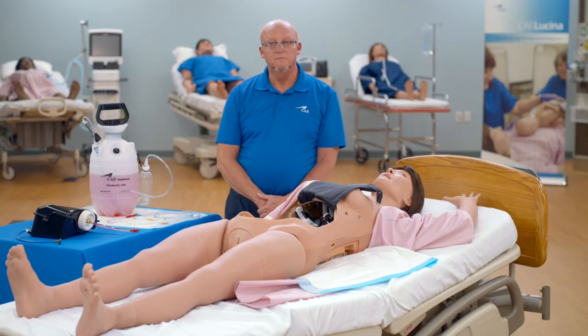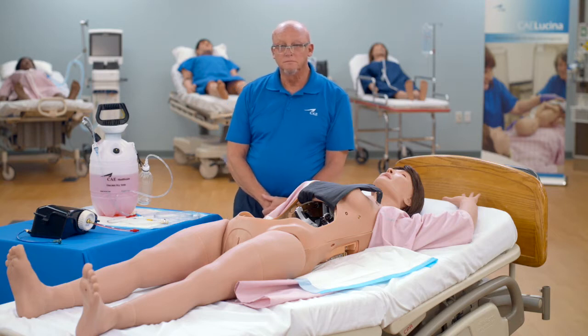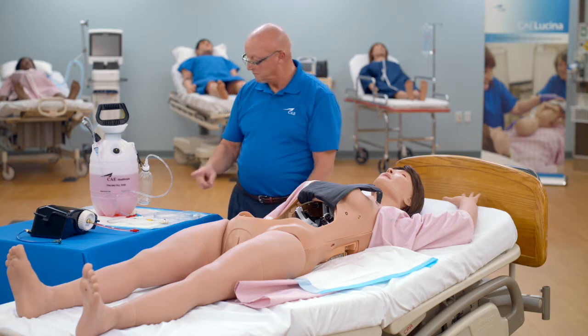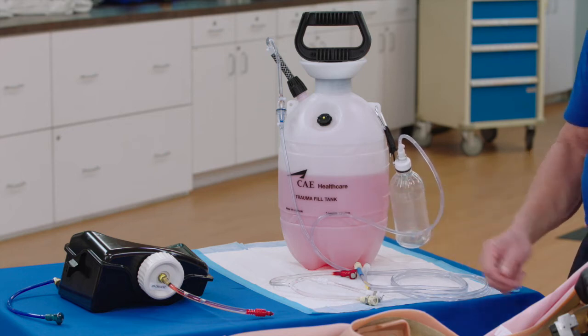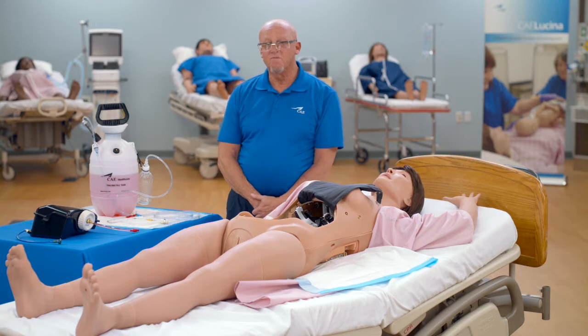To fill the two liter blood tank before it is installed in the mannequin, fill the trauma fill tank with about two liters of simulated blood preparation. CAE recommends a mixture of one ounce red food coloring to one gallon of distilled water.